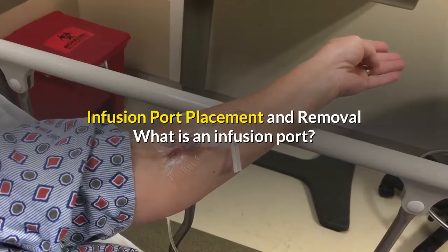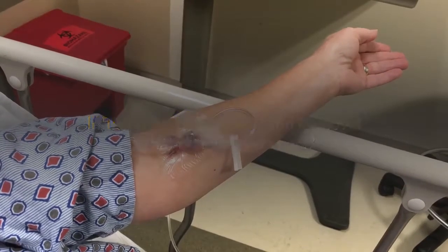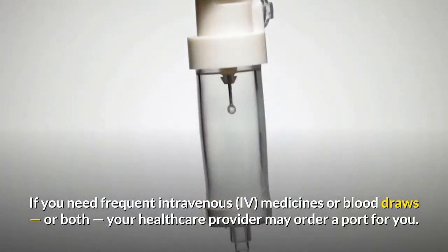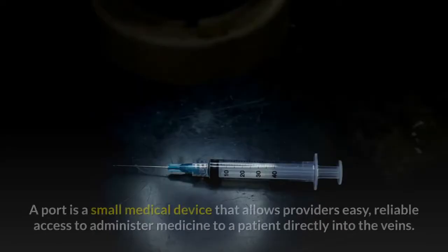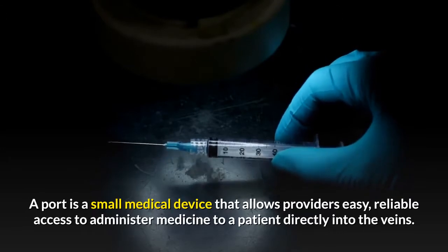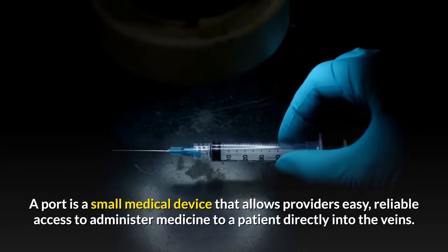Infusion Port Placement and Removal: What is an infusion port? If you need frequent intravenous, IV, medicines or blood draws, or both, your healthcare provider may order a port for you. A port is a small medical device that allows providers easy, reliable access to administer medicine to a patient directly into the veins.